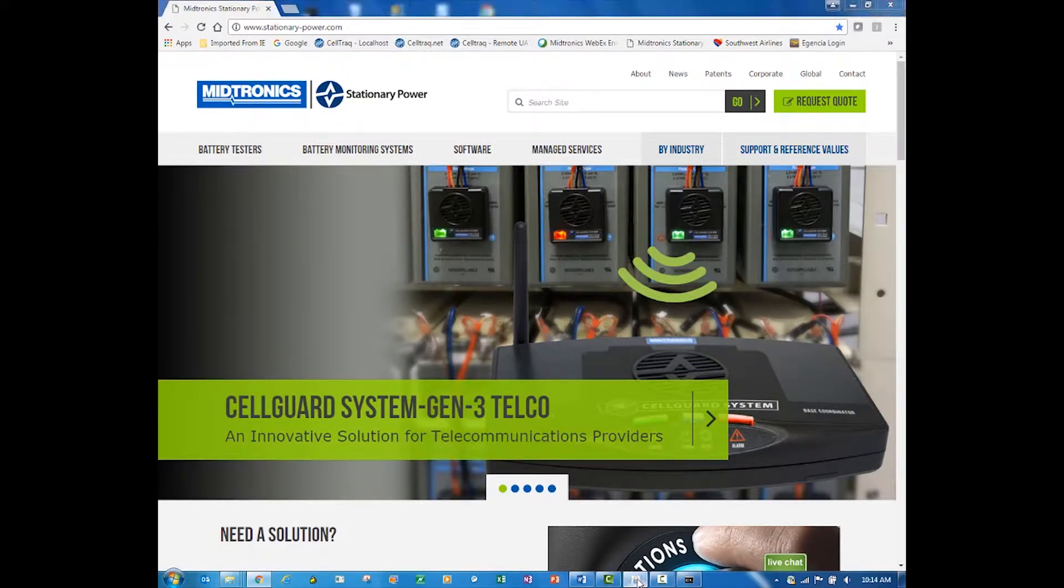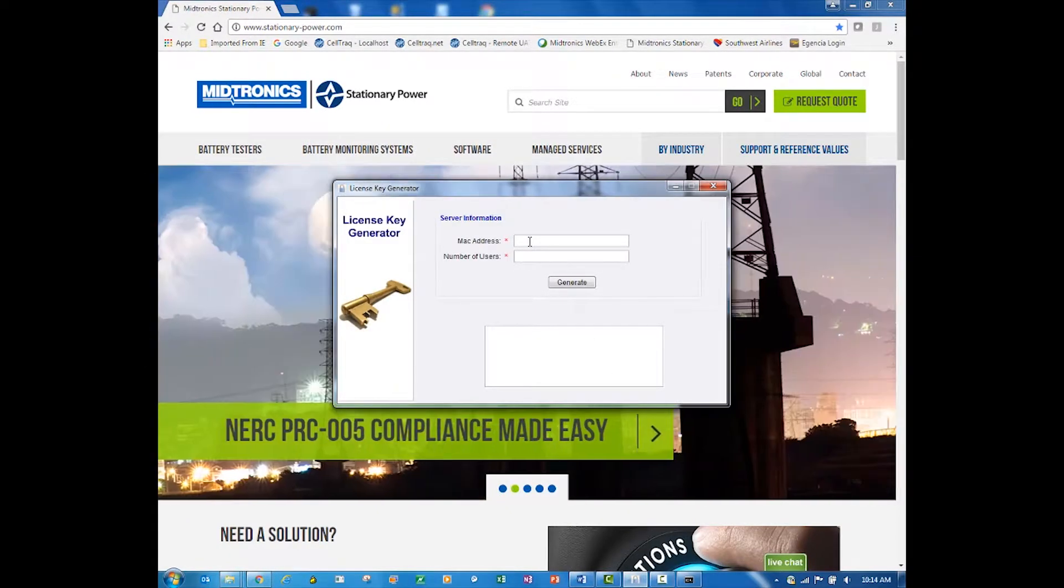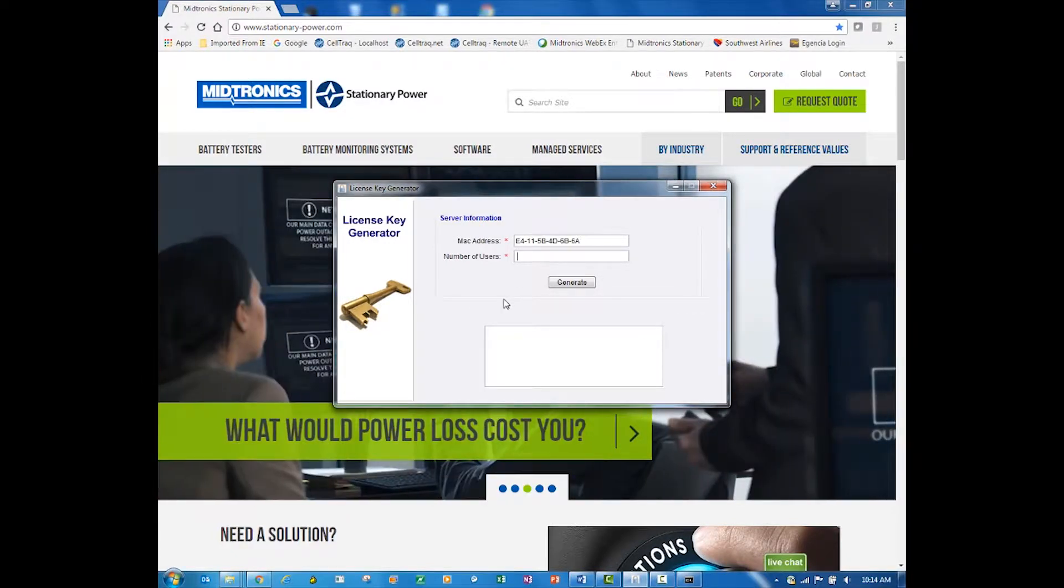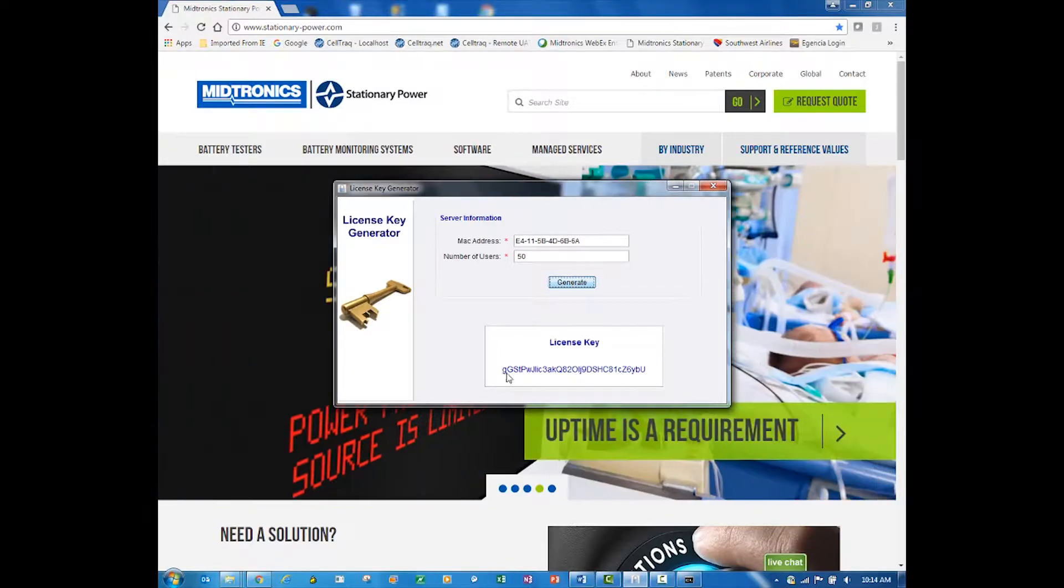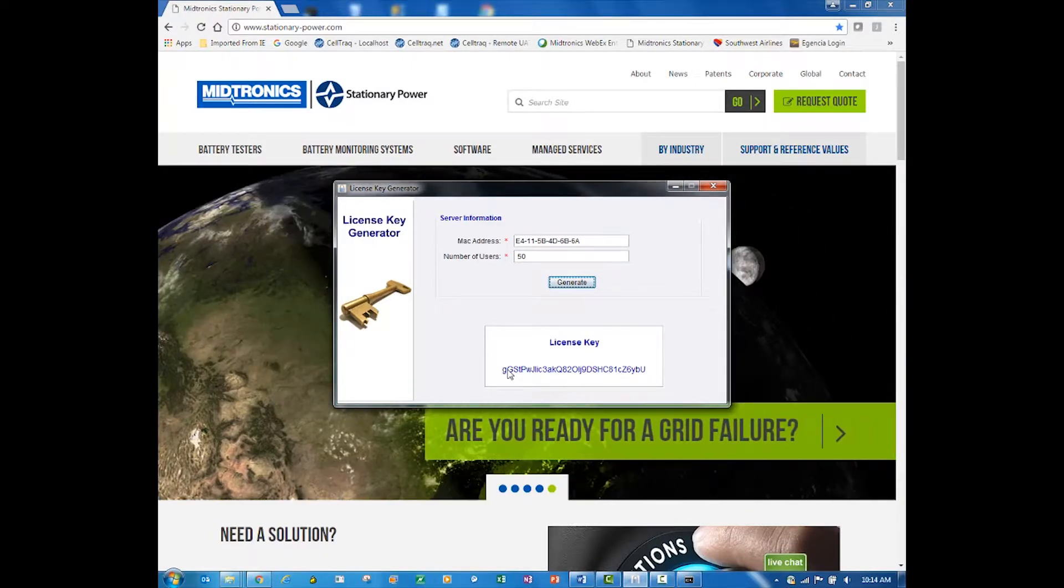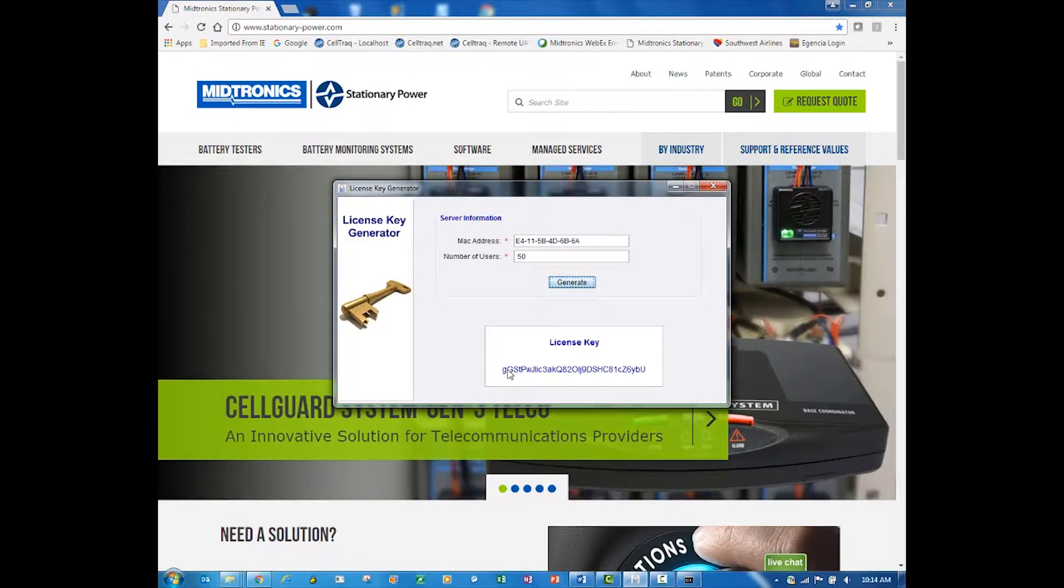Now that copied it, and you can paste that into an email and send it to Medtronics along with the number of users that you need. Medtronics has a little tool where we would put in your MAC address and the number of users to generate this license key.